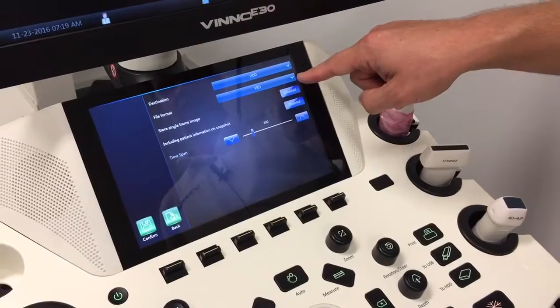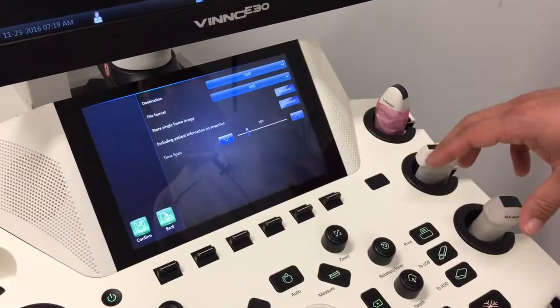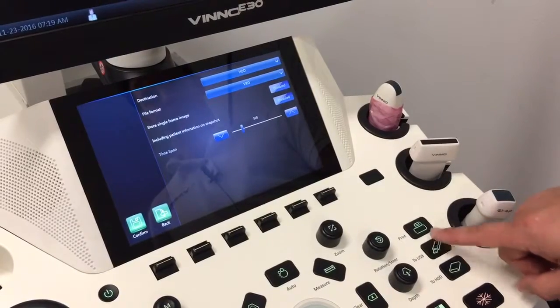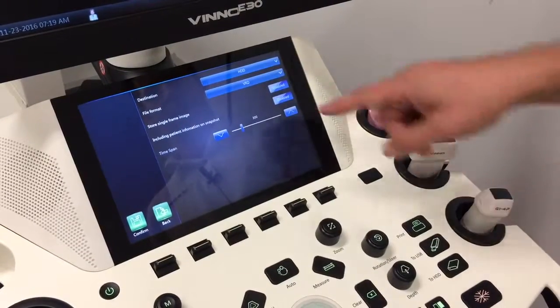Once the VRD is saved, you can still turn it into an AVI at a later time by having the image up on the screen and just hitting save to USB or save to hard drive in a different format.